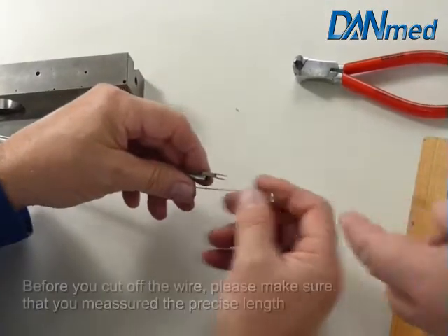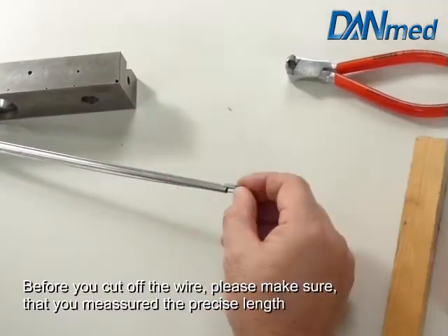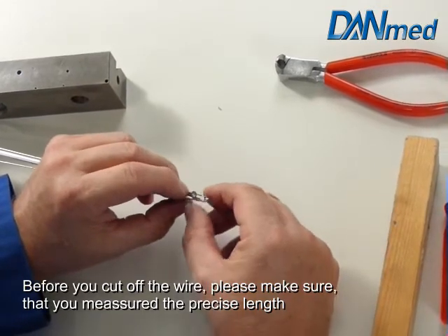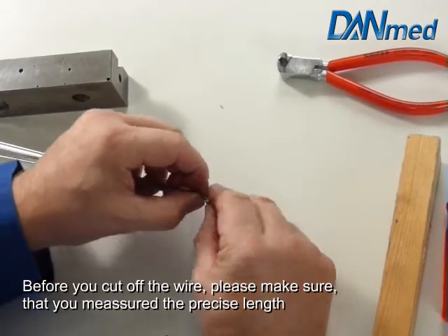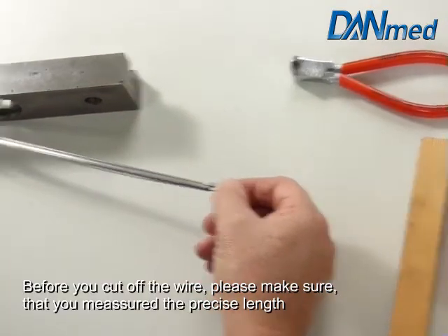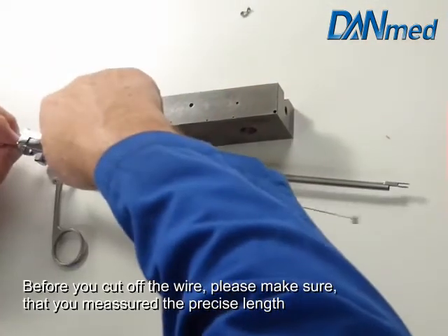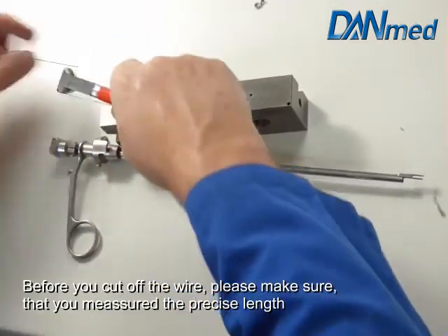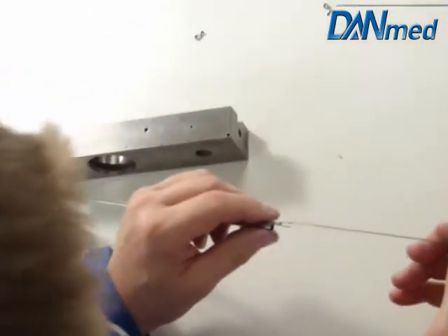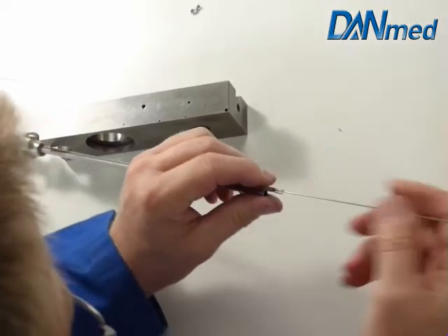Before you take the new inner stem in this instrument, make sure everything is cleaned inside of the tubing. Now we adjust the length of the instrument. We cut the right length and push the new insert back in the tubing.